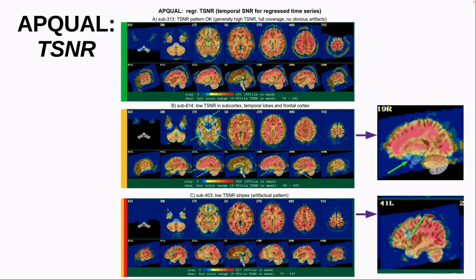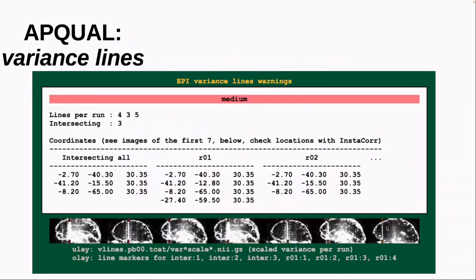It was very noisy. Every subject in the whole group had similar large artifacts, and these were extensive. So we ended up excluding the whole group in the Frontiers data sets. Okay, so let's go on to another set.